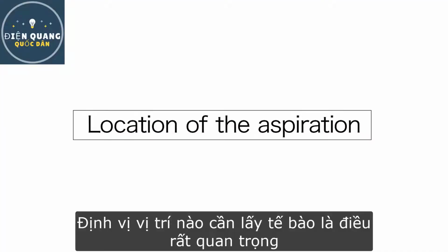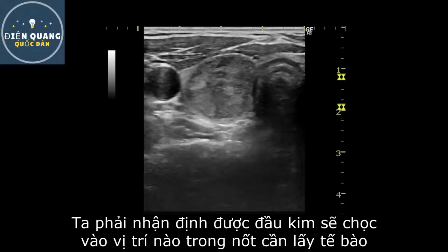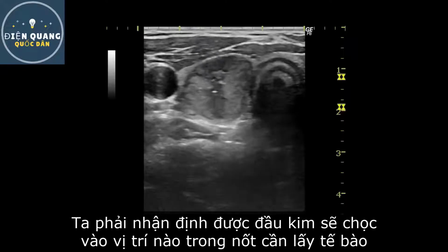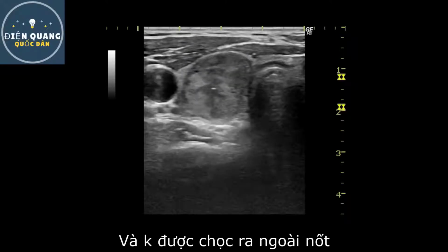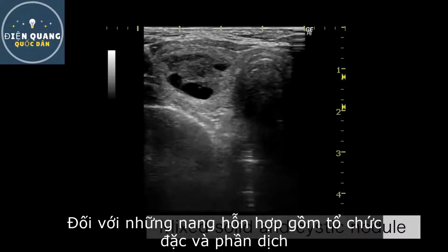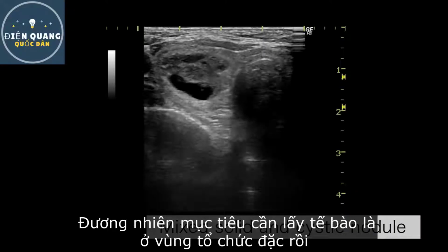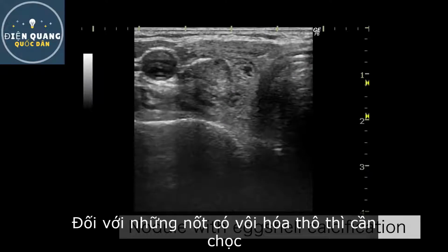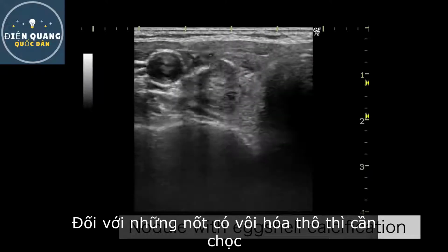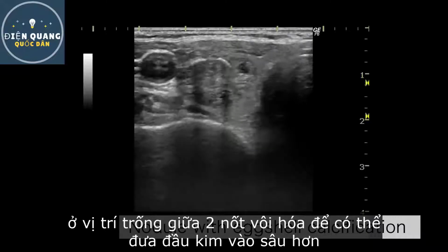The sampling site is very important. We must identify the needle tip within the nodule and must not protrude it outside the nodule during the piston movement. When the nodule is solid and cystic, the target should be the solid area. For the nodule with eggshell calcification, we can insert the needle through the disconnected portion.